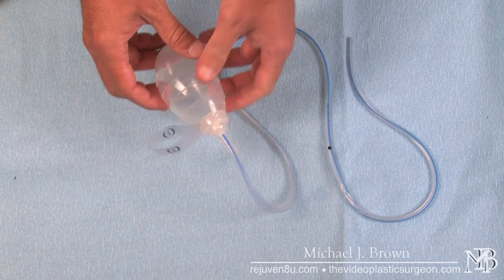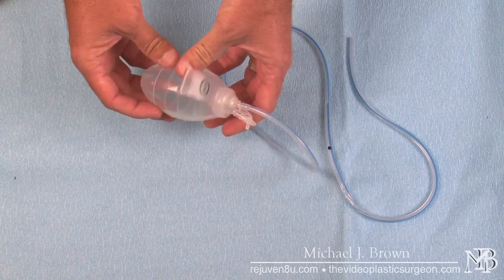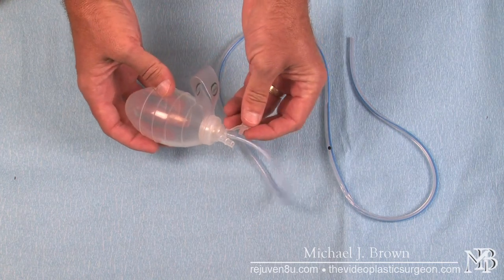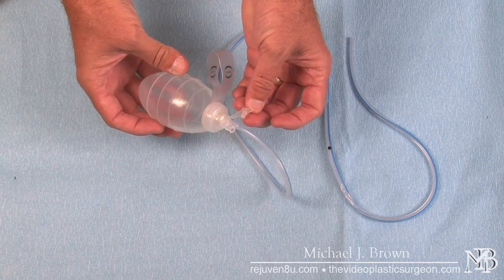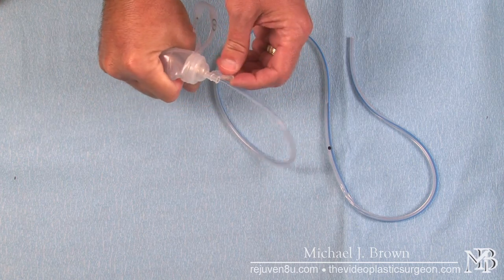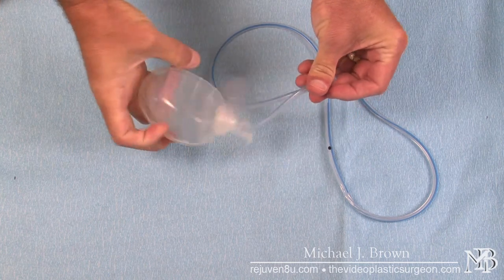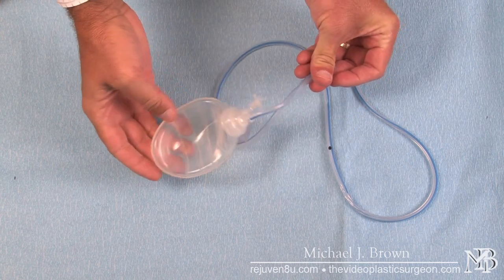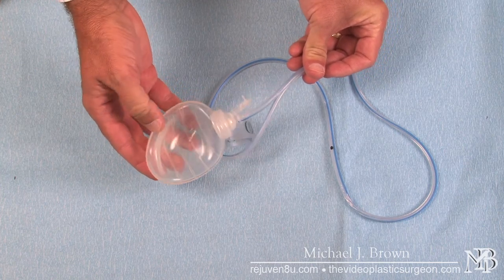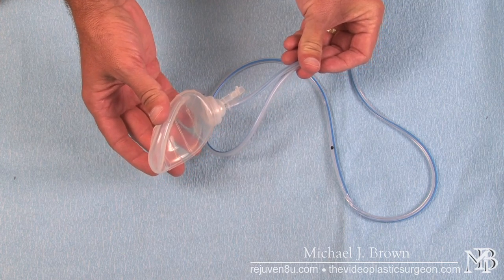These drains have a reservoir that is outside the patient and it's very simple to use. It works by suction — the patient will take the drain, remove the cap, squeeze it, and close it. The drain will stay compressed. It has a firm rubber or silicone reservoir which will try to expand, and as it expands it creates suction.